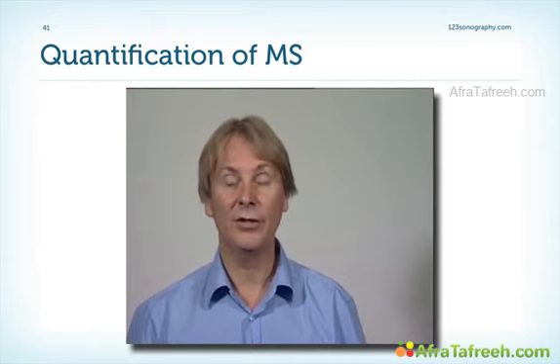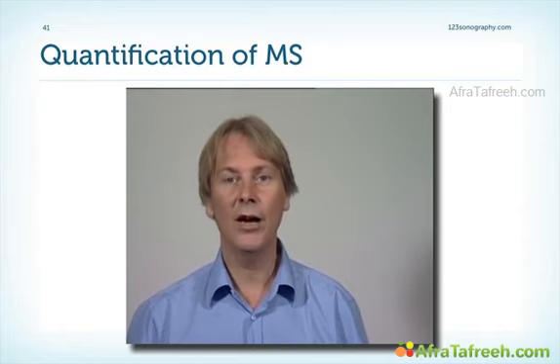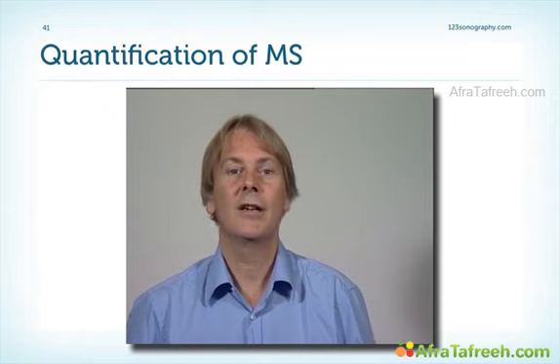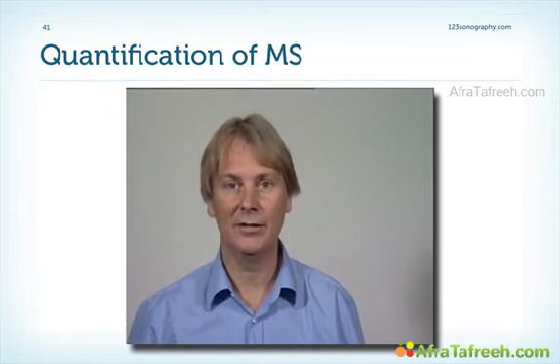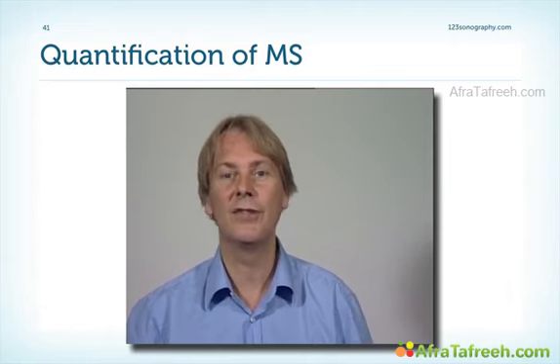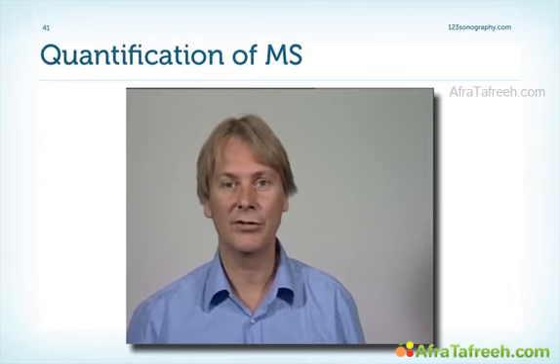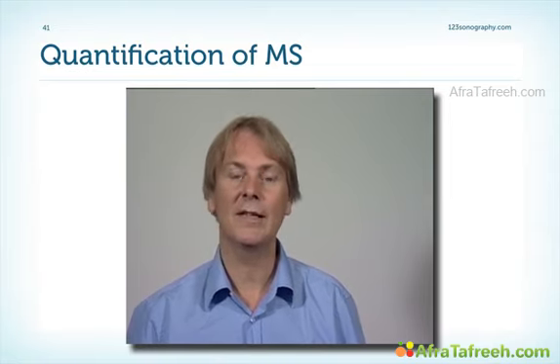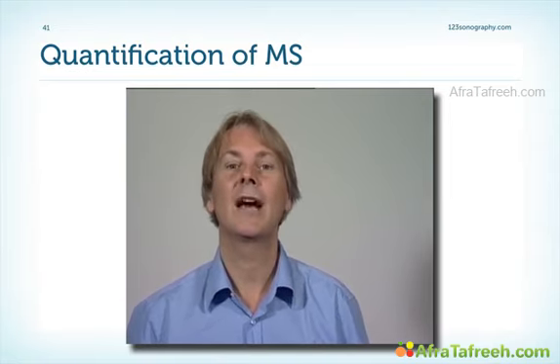Ask yourself the question, why is that so? And look for other problems the patient might have. And also, of course, ask yourself, how symptomatic is the patient? Does it fit to the degree of severity that you, for example, are diagnosing with echo? Now we'll turn to how we can treat these patients and how echo can help us to decide how we can treat them.